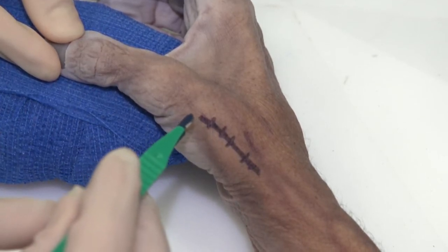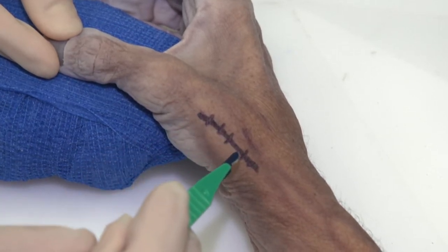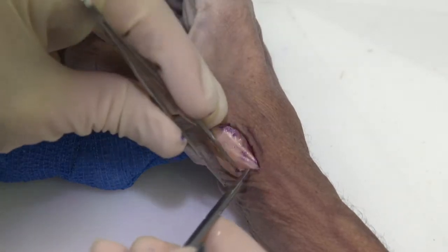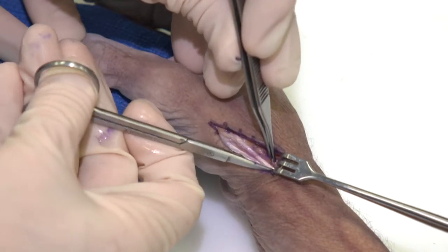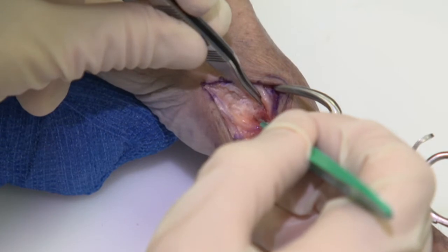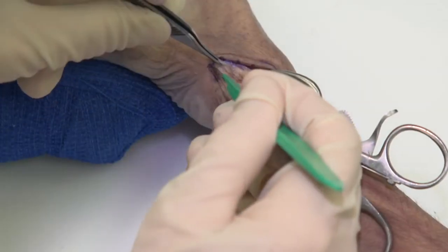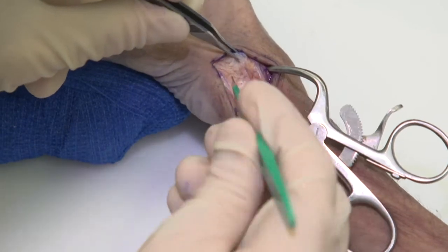The incision is based along the dorsal surface of the metacarpal and the first dorsal compartment. One must be careful to avoid branches of the radial sensory nerve. We initiate the procedure by first identifying the tendons of the first dorsal compartment and we do release the first dorsal compartment. We're now exposing the trapezium, with the section carried down to the radial artery — as you see right at the tip of my knife blade — and from there we're elevating capsule off of the trapezial bone and the base of the thumb metacarpal.